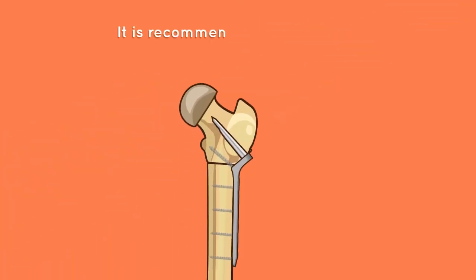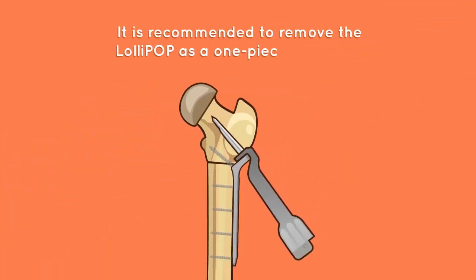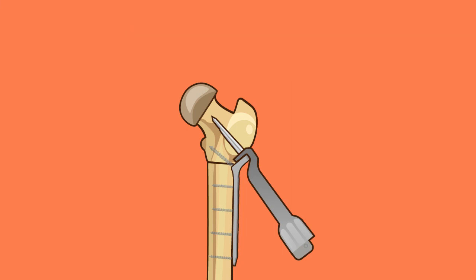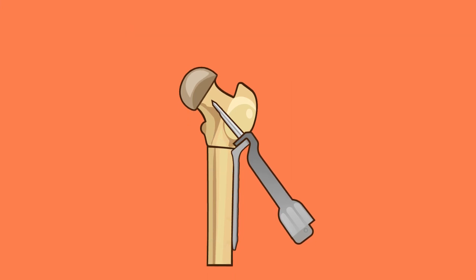Implant removal: It is recommended to remove the lollipop as a one-piece assembly. First, remove all cortical screws from the plate. Then, using the appropriate crowbar, wedge the plate off the bone by gently tapping the top surface. If required, the slap hammer can be connected to the crowbar to help the removal.